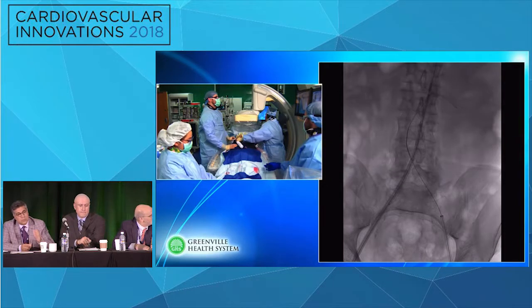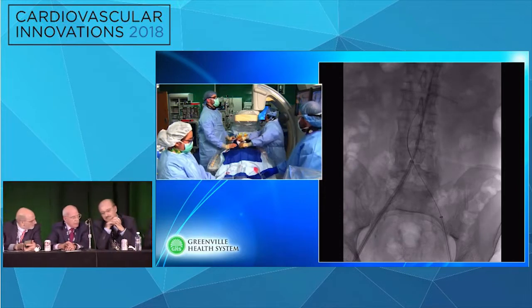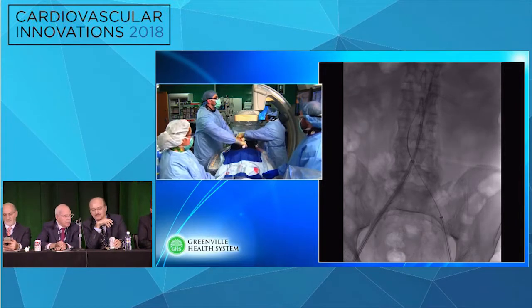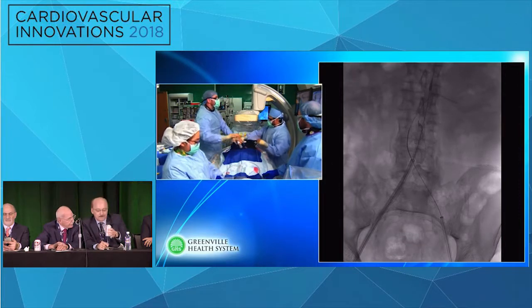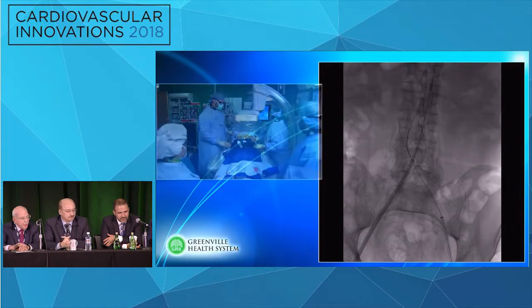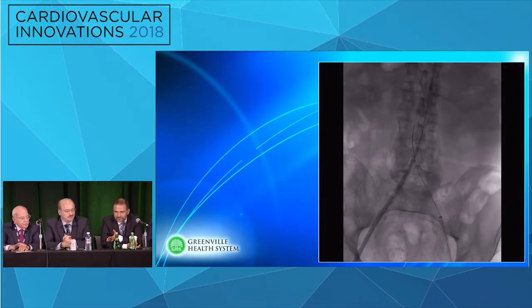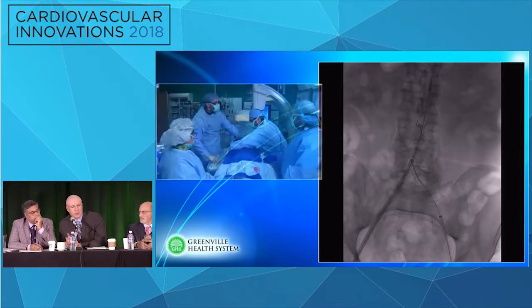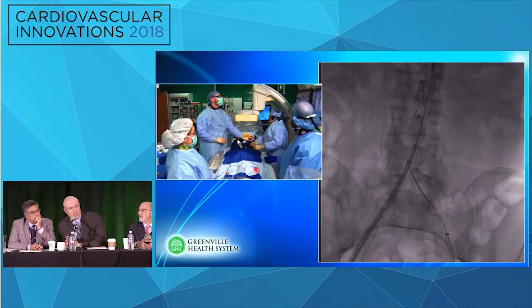Maybe at the Shark Tank, they presented a device for orienting and co-registration. Remember they use it at Cleveland Clinic. Have you used that, or do the surgeons use it? I think Subhash is talking about it, we had an innovation summit Wednesday, pre-symposium, and Centerline, as you recall, Roy Greenberg was one of the pioneers of the Centerline system. So the argument with Centerline is that you reduce radiation and make the case more efficient. I think it may be helpful for more complex fenestrations and complex disease, but for a straightforward AAA, I don't know, Steve, what do you think, Steven? No, similar thoughts. If you've got complicated fenestrations and you're having to do a snorkel or a chimney, or you're really pushing the IFU on some of these cases, you want to use every adjunct.